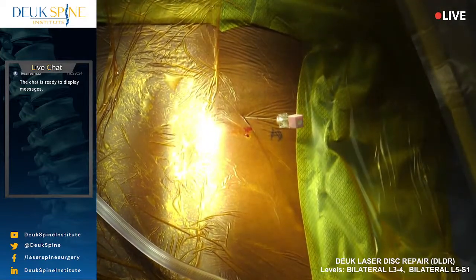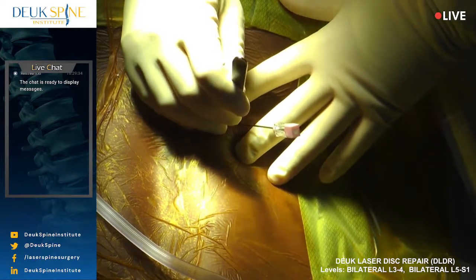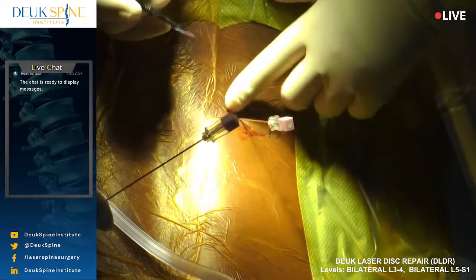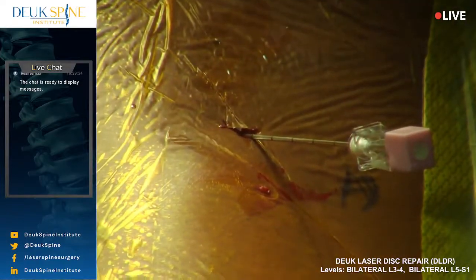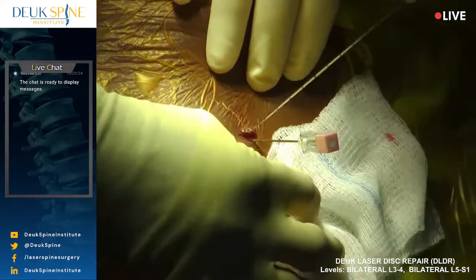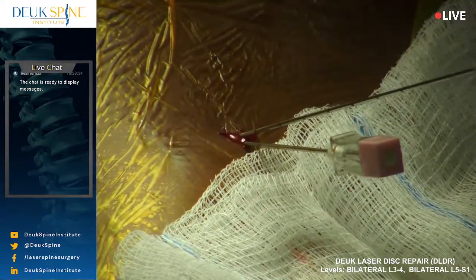Incision. So we've got 1 in place. We've got 4 to do. Let me know if it's uncomfortable, okay? We make our 7mm incision. We're going to do the whole surgery through a 7mm incision. I want to make sure we get a nice clean incision. Once you make an incision, it's no longer a percutaneous procedure, it becomes a surgery. A lot of people don't know that.